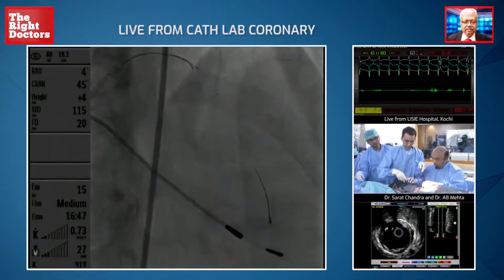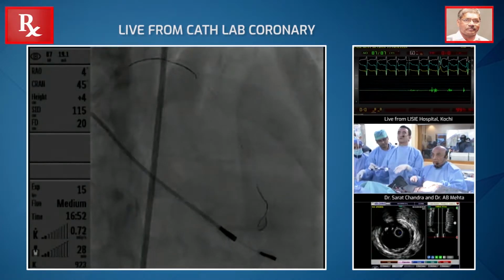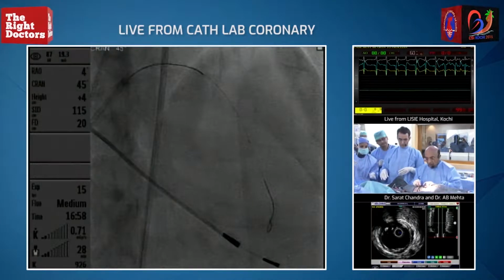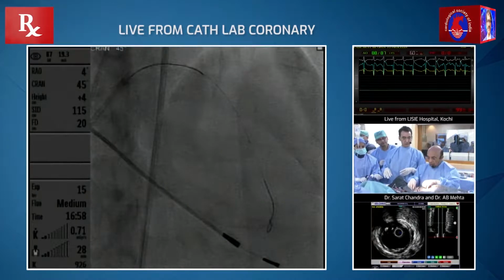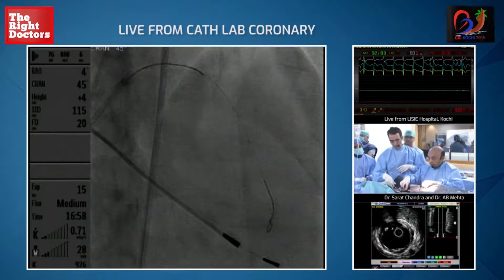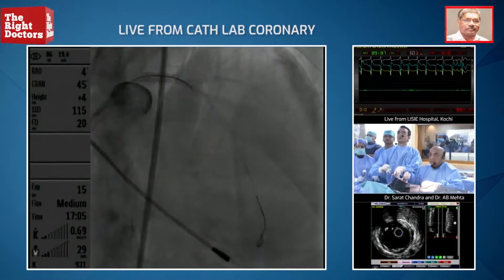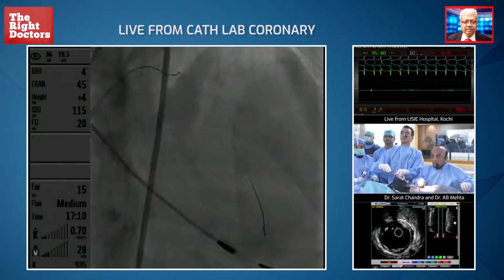So we're basically trying to work out flow, and if we can get resistance stable, then we can work out flow. Next slide. So pressure in that situation equals flow if we can knock out resistance. Next slide. So we give adenosine usually, and on the bottom here you see how adenosine reduces resistance.